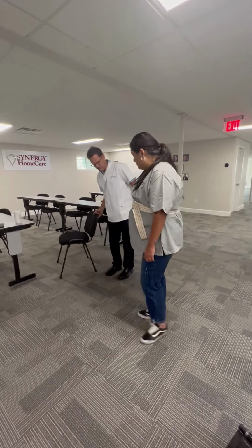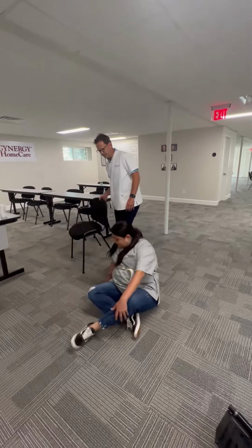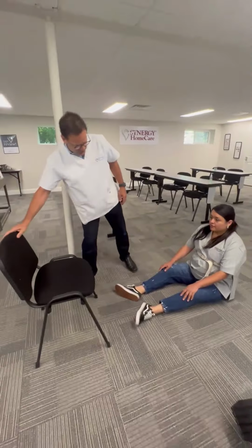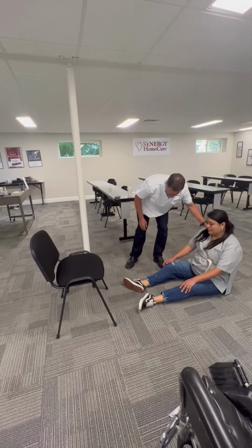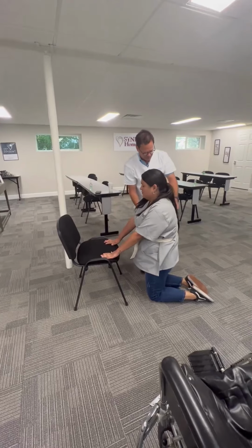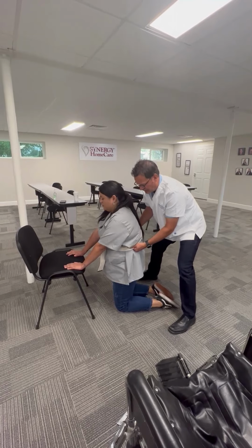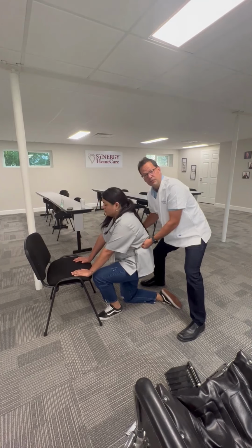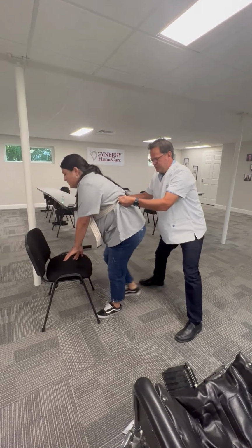If Giselle were to go on the floor, go ahead, Giselle. I know you didn't think you'd be on the floor today. So Giselle is on the floor. I am going to get her back onto her feet. I'm going to use a chair to assist. So I'm going to ask Giselle to move onto her knees, if you could, and to be in a position with her hands on the chair. I'm going to position myself behind her. I'm going to take a hold on each side of the belt, and she's going to assist me. I'm going to ask her to put one leg forward, and on 3, we're going to stand up. Ready? 1, 2, 3. So Giselle is back up.